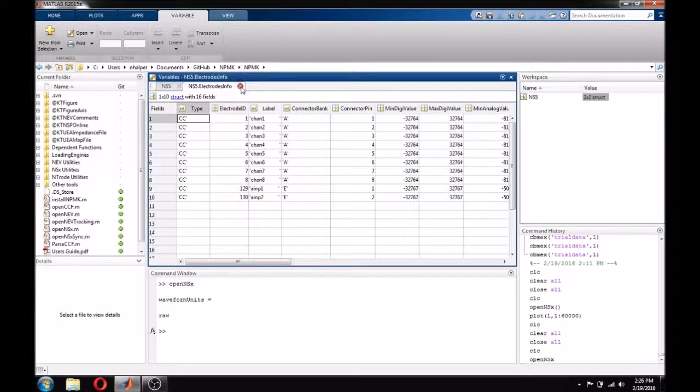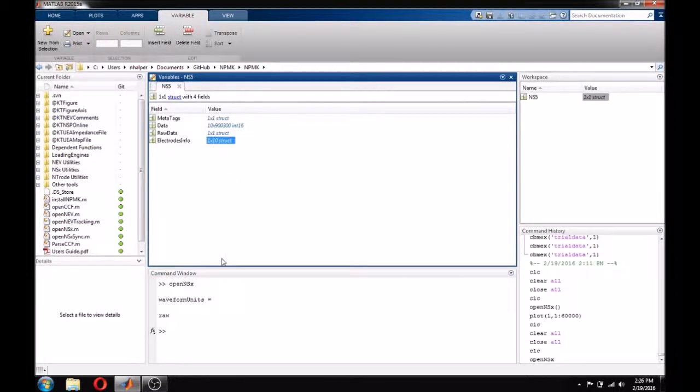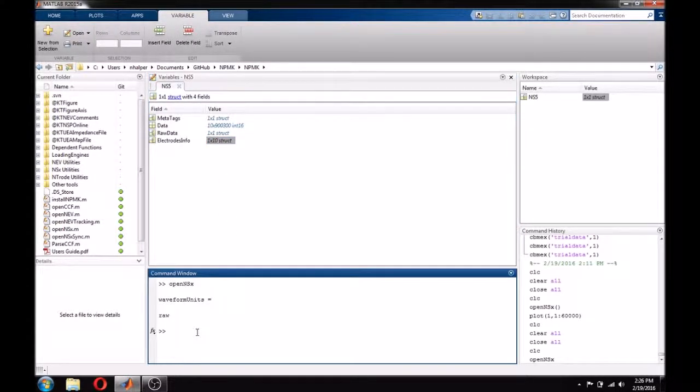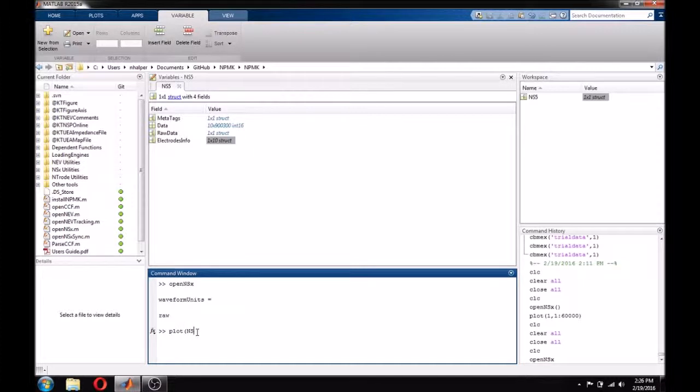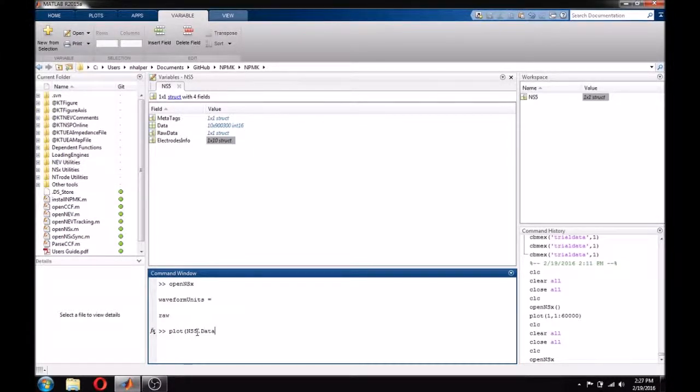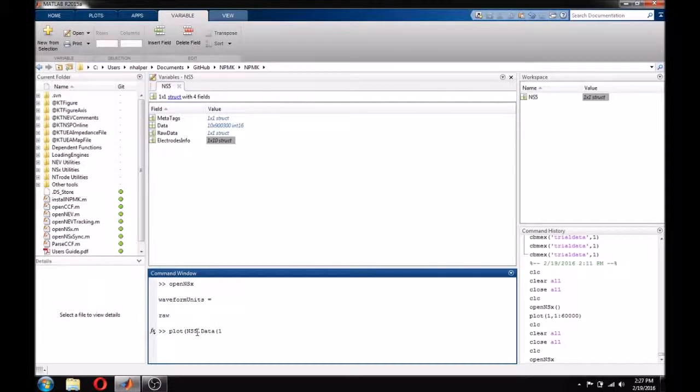With the organization of the data structure, it is really easy to plot a signal. I am going to plot the first couple seconds of channel 1 of this data file. Since I know that I am sampling at 30K, I can simply plot from 1 to 60K to capture the first two seconds.